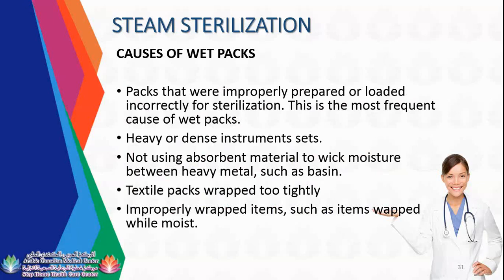So, the process of wet packs. Wet packs means the instrument is not properly dry. Packs that were improperly prepared or loaded incorrectly for sterilization are the most frequent cause of wet packs.